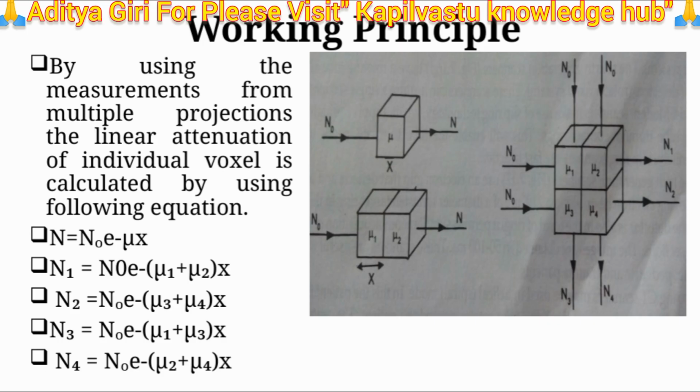And this is how multiple projections work together in the working principle. By combining these measurements, we can accurately reconstruct the internal structure with high precision. It's a clever way to interpret the data and get detailed insights into the composition of what we're imaging.